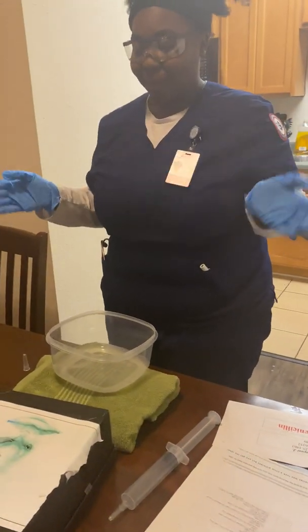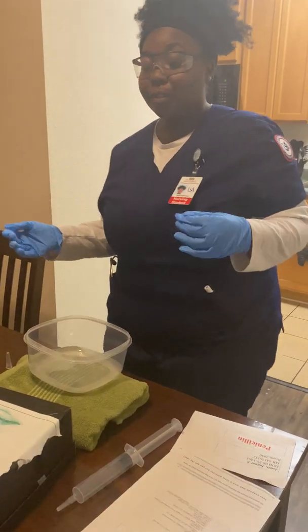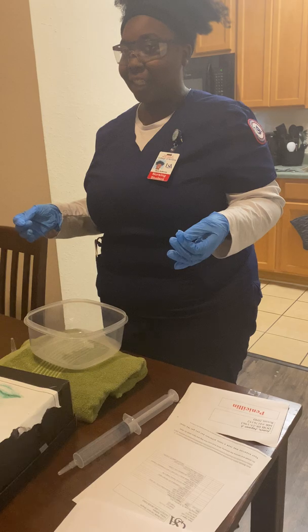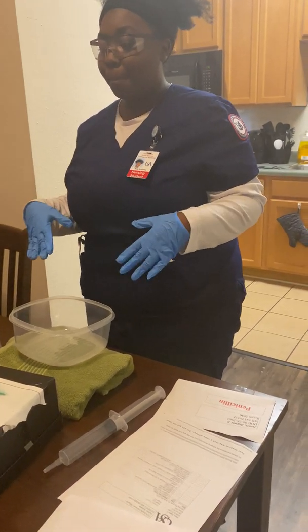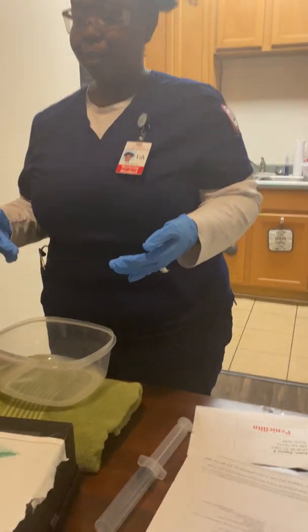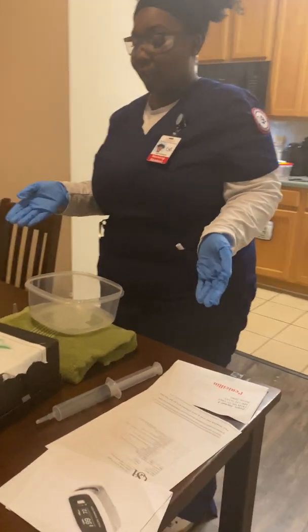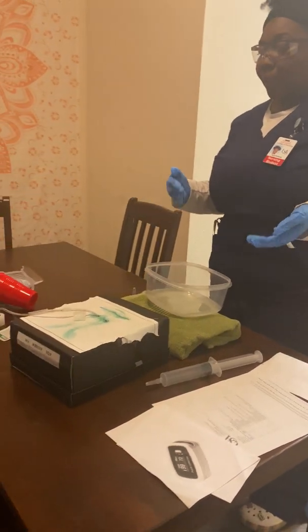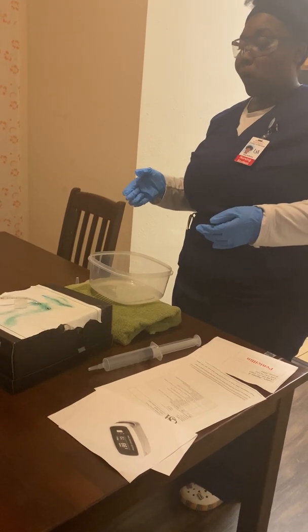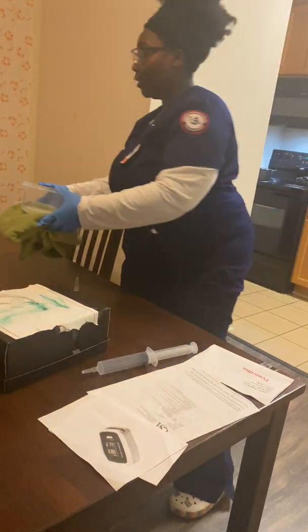So once I have done that, after that has been placed and everything, then once I have completed my procedure, I'm going to get ready to position the call light in reach, lower the bed back down, raise the side rails back up, and then assess the patient for comfort. And then I'm going to raise the head of the bed no lower than 30 degrees. I'm going to remove the towel and everything.